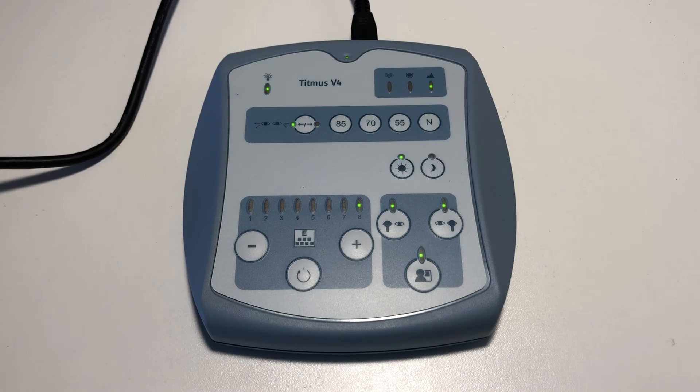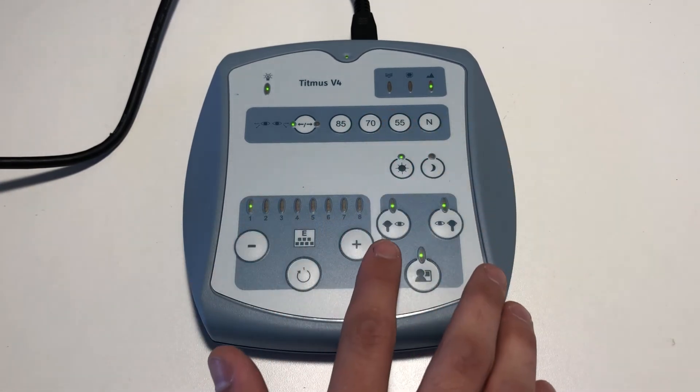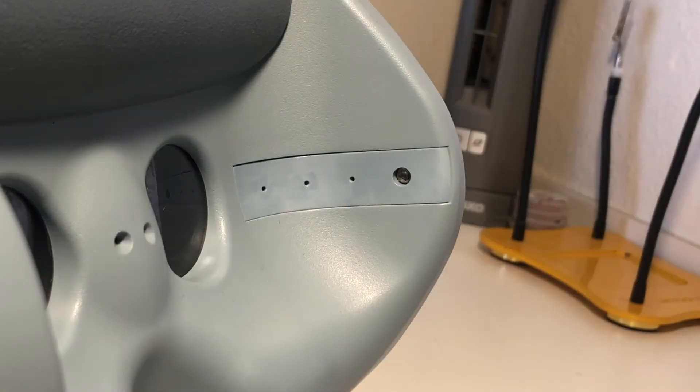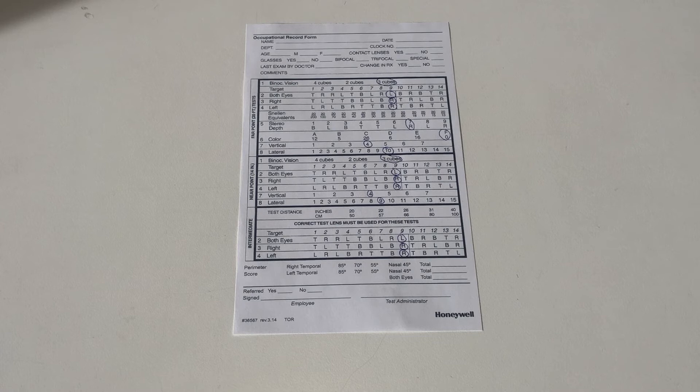Advance the slide back to number 1. Here we will be testing for peripheral vision. Ask the patient to raise their hand each time they see a light flash. We will test for temporal vision at 85, 70, and 55 degrees, followed by a 45 degree nasal test. On the record form, record the total field of vision the patient was able to perceive, which is the temporal results added to the nasal result.